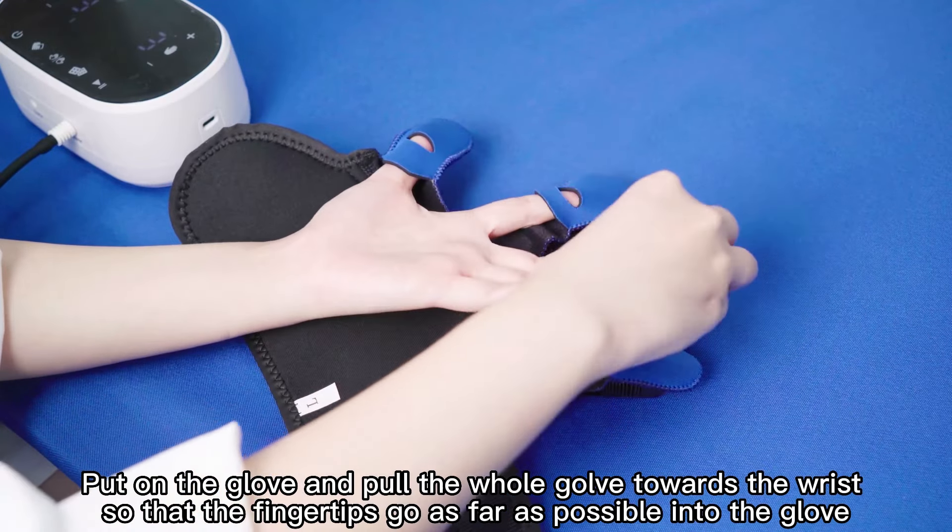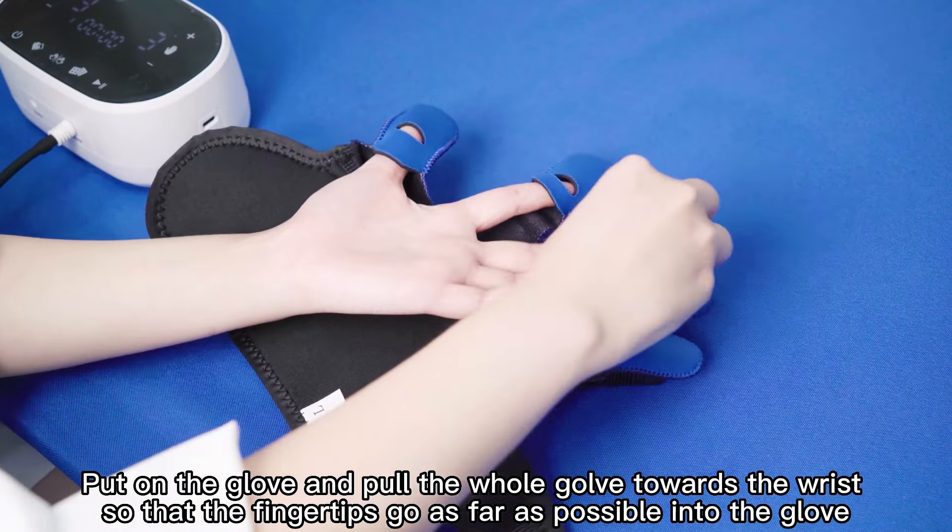Put on the glove and pull the glove holder towards the wrist so that the fingertips go as far as possible into the glove. Then tighten at the wrist and fasten the velcro of the lateral strap without discomfort.